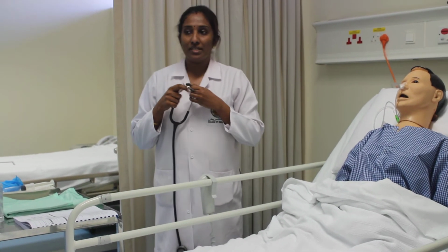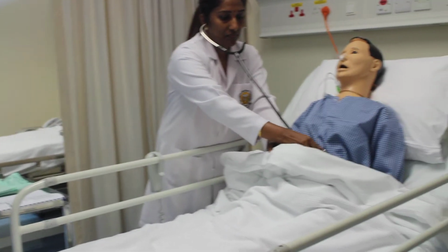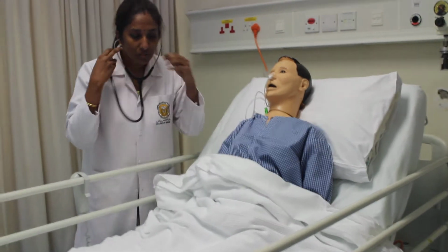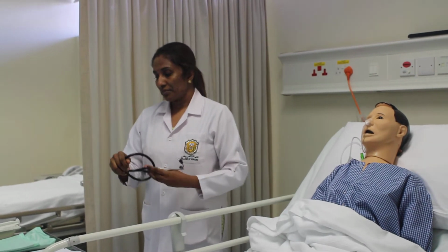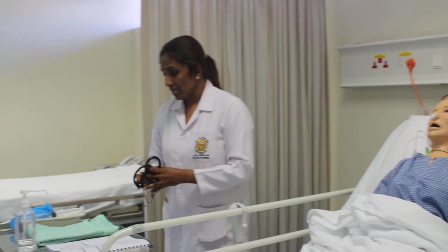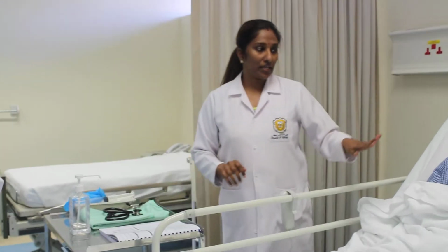Let me check the bowel sounds. As you have learned in the feeding video, you will be checking the bowel sounds. Okay, the bowel sounds are good. You may need to wait for 1 minute to 5 minutes to listen in all the quadrants. But here I have got the bowel sound, so it is fine to remove.